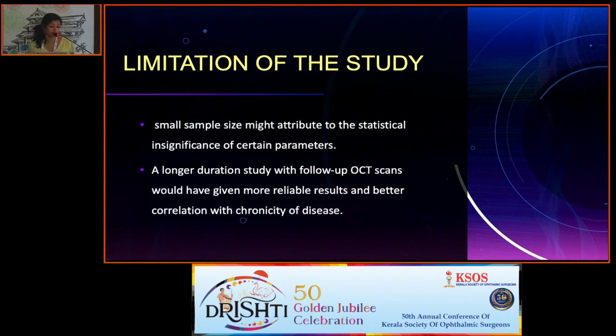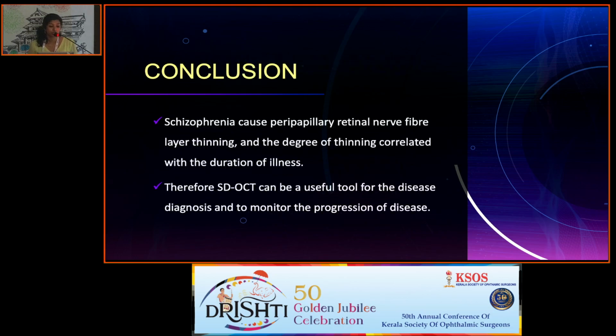A limitation of my study was the small sample size, which might have attributed to the statistical insignificance of certain parameters. A long duration study with follow-up OCT scans would have given more reliable results and better correlation with chronicity of disease. To conclude, schizophrenia caused peripapillary retinal nerve fiber layer thinning, and the degree of thinning correlated with the duration of disease. Therefore, SD-OCT can be a useful tool for disease diagnosis and to monitor the progression of the disease.